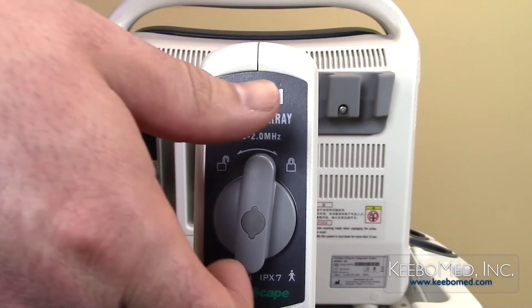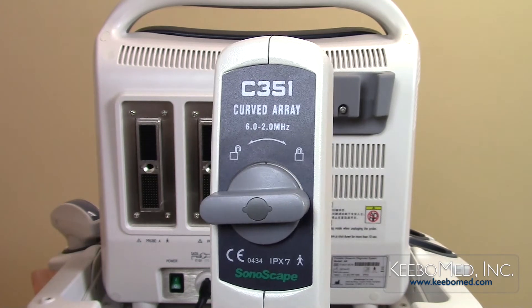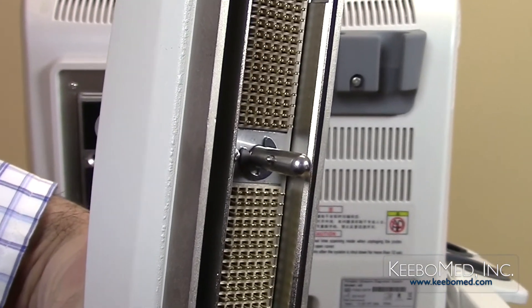Step 2. Turn the probe lock counter-clockwise to the unlock position. The small tongue of the probe lock inside the probe connector will be positioned to the left.